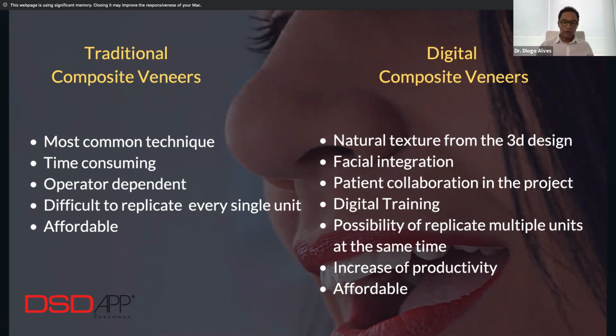We all know how to do it. However, it is time consuming, especially when you're doing 6, 8, or 10 composites. It is very operator dependent, so it depends on the skills of the doctor. It could become a little difficult to replicate every single unit, but it is an affordable option for the patient.